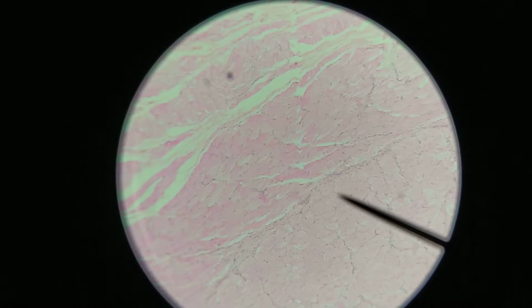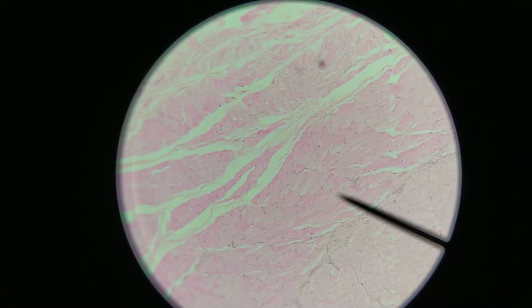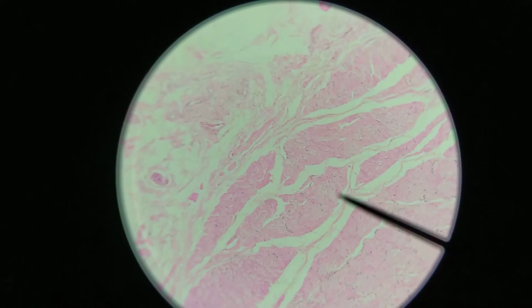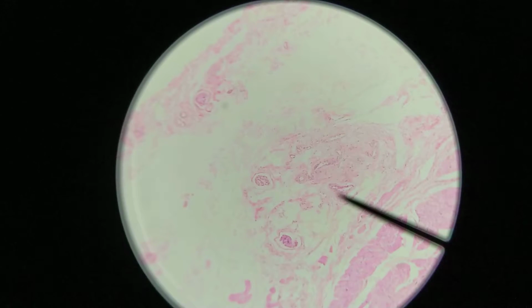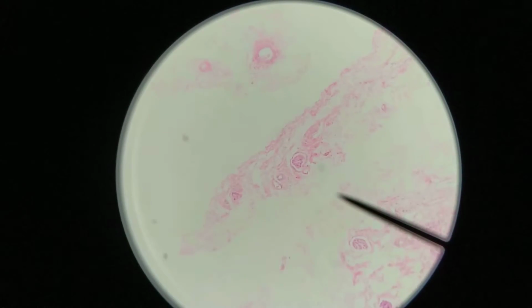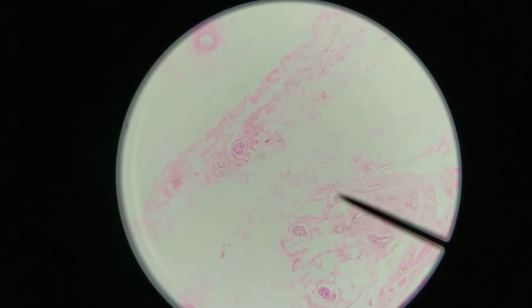And as we go further away, in this region here is a second layer of muscle. This is the outer longitudinal muscle, and what you're seeing here is actually somewhat longitudinal looking sections through muscle here. Okay, and that would be that outer longitudinal layer of muscle, so it's running along the length of the esophagus. Now beyond this muscle we have this kind of a connective tissue layer. There is no boundary out here, so this is the tunica adventitia. Okay, so basically the connective tissue layer out here merges with the connective tissue that surrounds other structures.